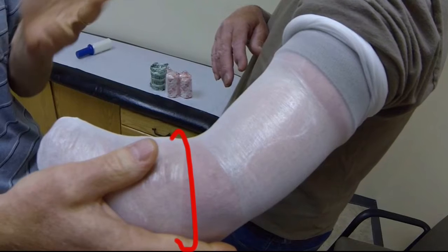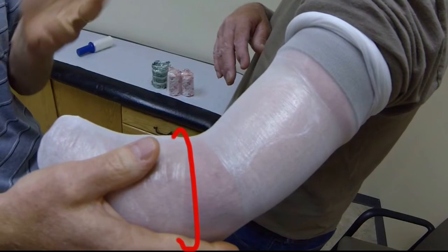Take a circumference measurement just distal to the antecubital fold and record.